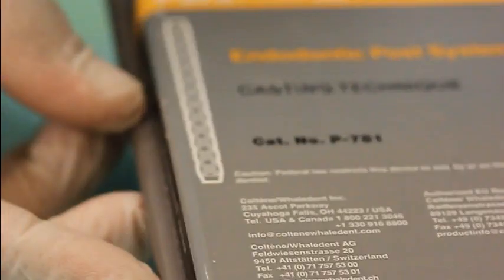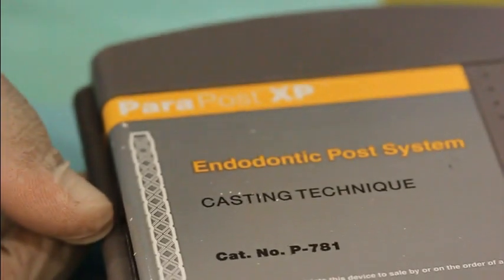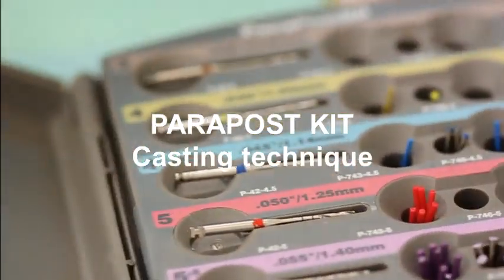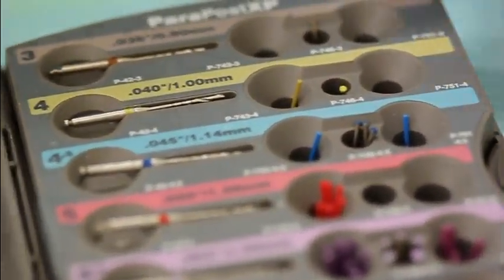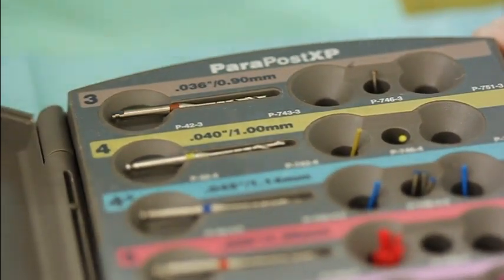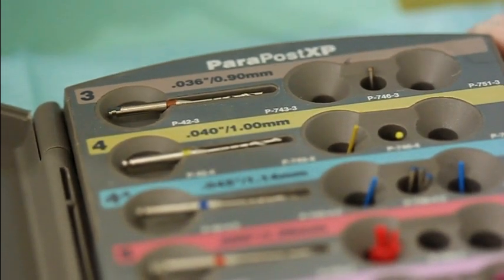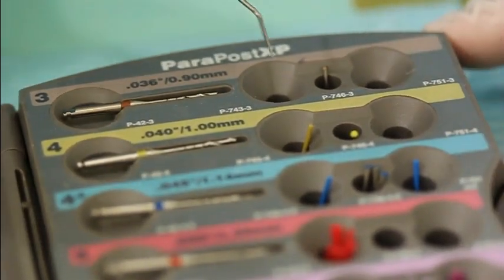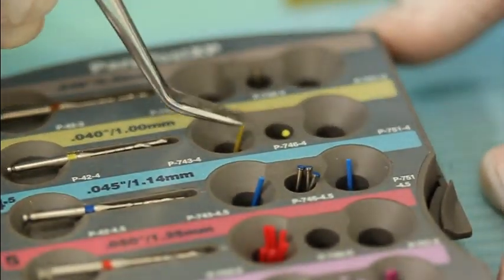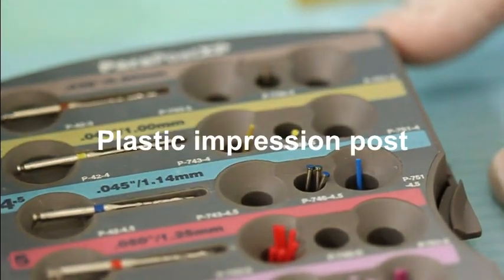Okay. What you need is the PARAPOST endodontic system for casting technique. Basically they are just the same as the one that I showed you previously. It's just that they have 3 other materials. The first one is the impression post, the one that needs to be inserted into the canal later, the smooth surface one.